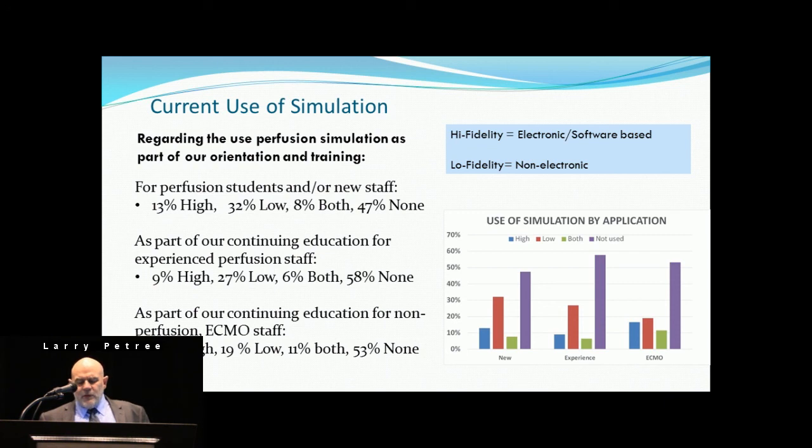The next question was, as a part of continuing education for experienced staff: 58%, no use of simulation. Only 9% using high, and 27% low. So of those using simulation, we still do a lot of lo-fi sim, which is very valuable. You've probably got expired circuits and a way to practice that.